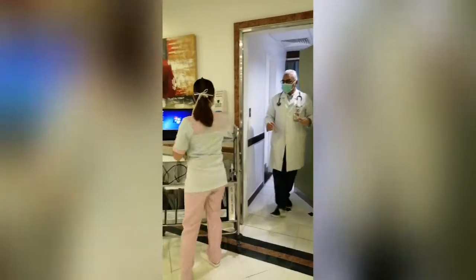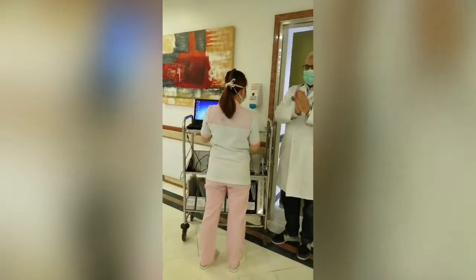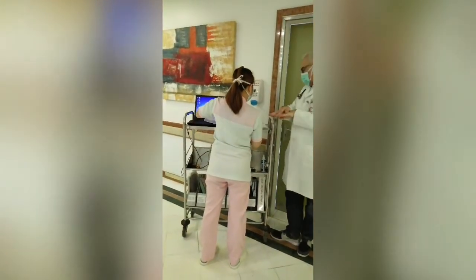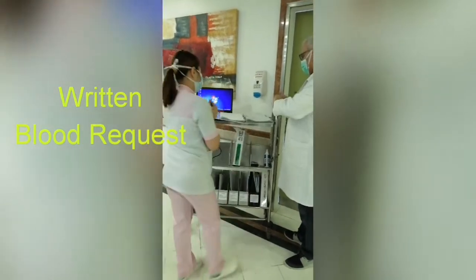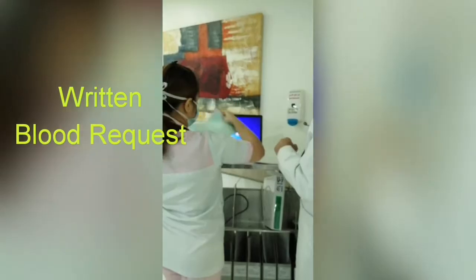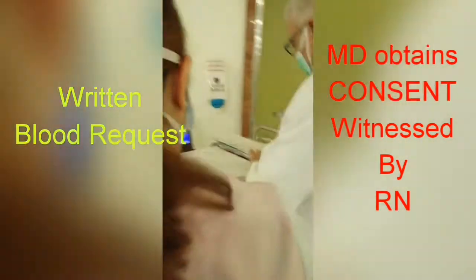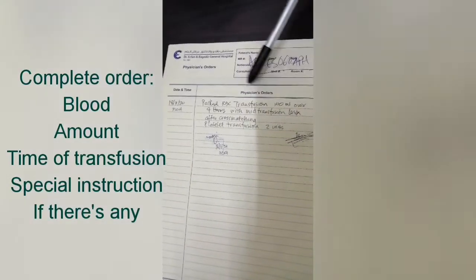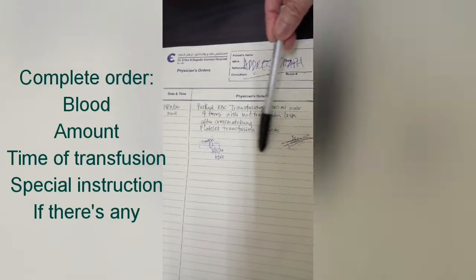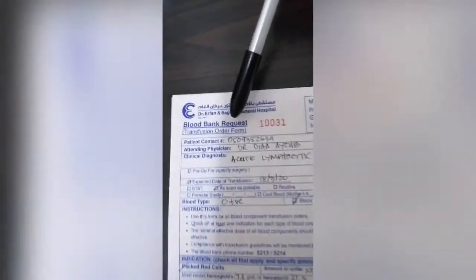Blood requisition process starts from receiving the physician's order. It cannot be given without a written request. Check the doctor's order for completeness. Carefully compare the doctor's order with the blood request form.